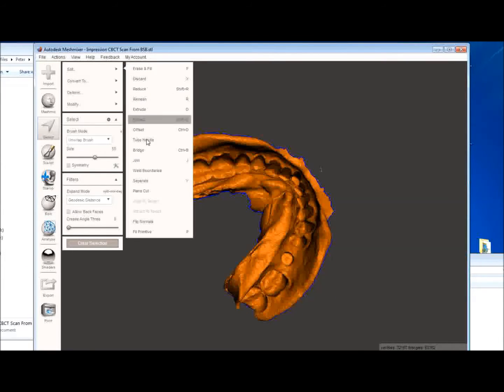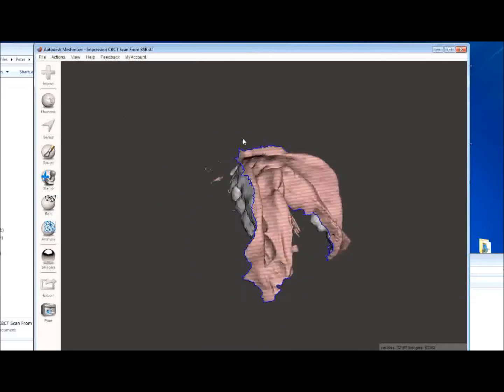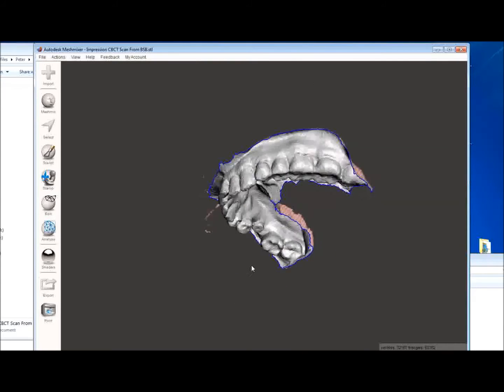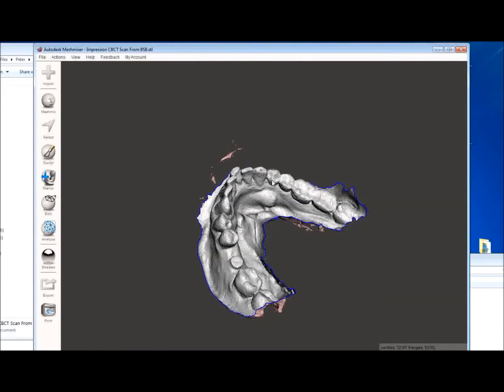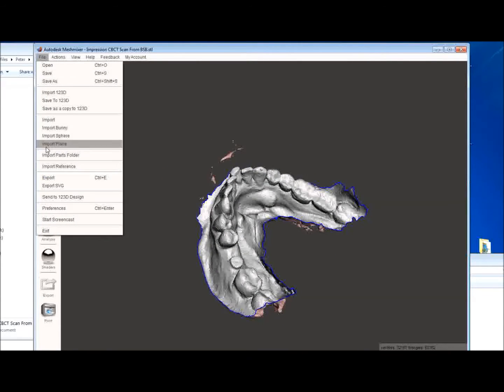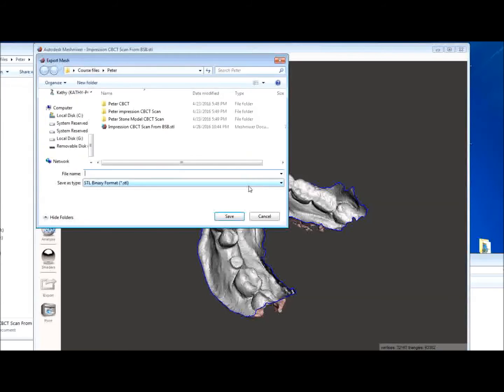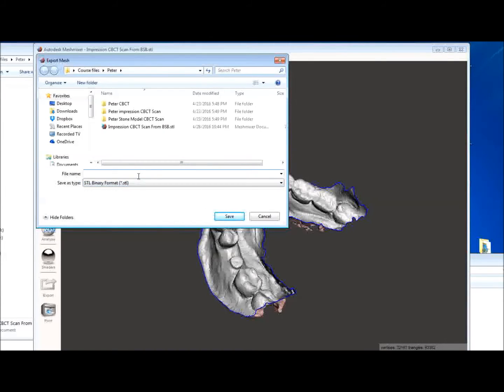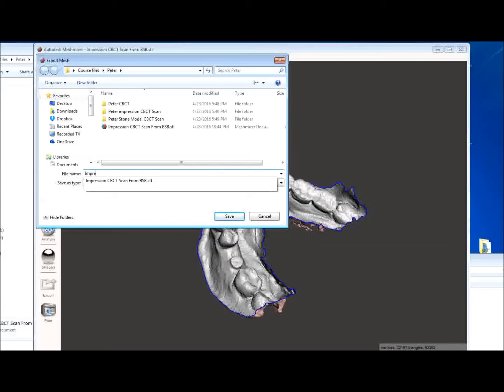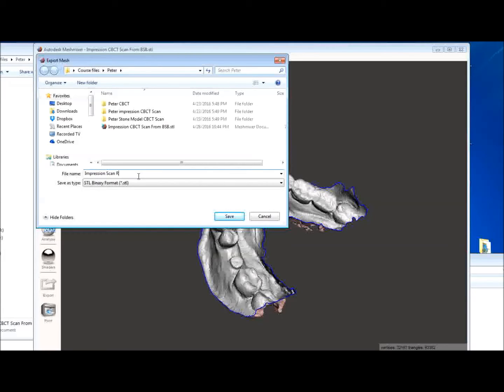Go ahead and hit edit. Flip normals. And now that's reversed and we have a positive image. We can then export this. And this time we're going to call it impression scan reversed or inverted if you like. And we're going to save that.